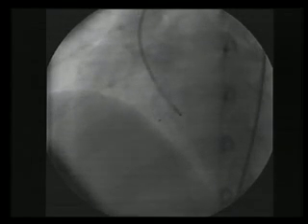So there is some tricuspid regurgitation. Remove your hand. Is that an LV to RA shunt or tricuspid regurgitation? That is an LV to RA shunt. Yeah, it was present before also. You can see the angiogram here, very nicely positioned device on both sides, LV, RV and central waist. I think if you do an echocardiogram, we are ready to deploy the device.